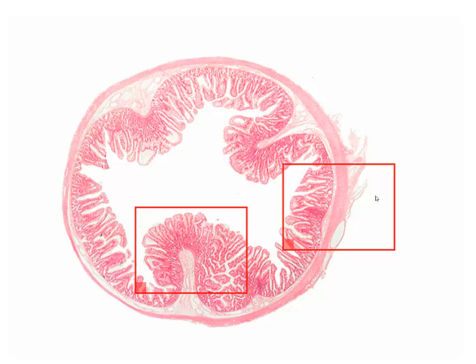Now, just the plicae circularis alone, this is going to increase our surface area by a factor of 3, just counting for these specializations. Now, in a cross-section of intestinal tract, what we can see is we see our muscularis externa on the outside. We have our submucosa, but then notice how our mucosa is folded in. In some areas it's kind of small, but here we see an extensive fold coming in. Here we see another extensive fold coming in. These are cross sections through, each one of these being the plicae circularis.